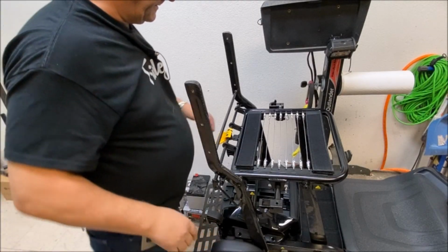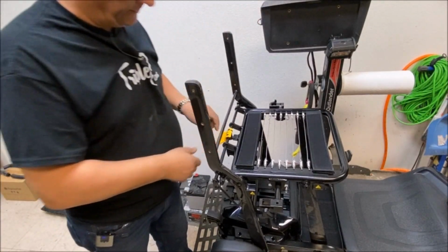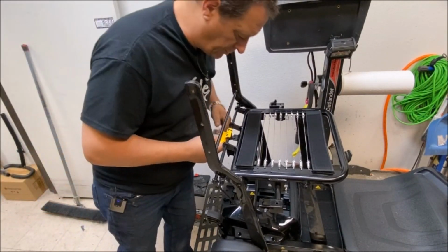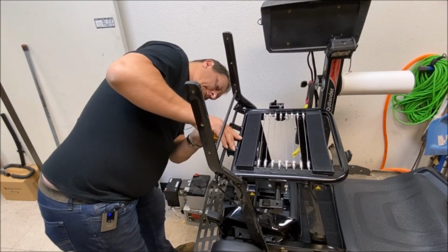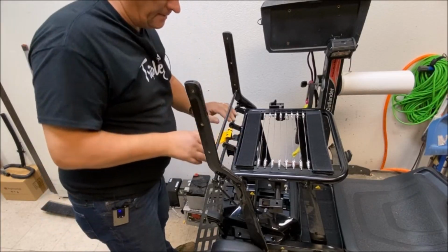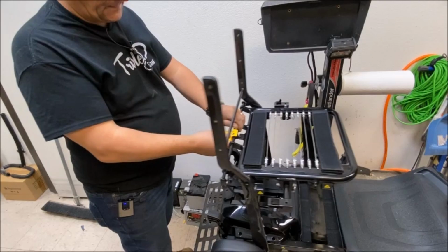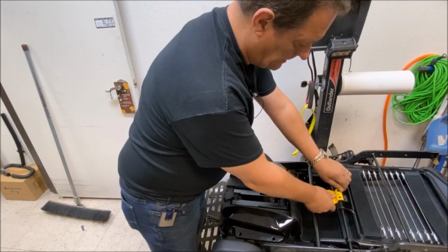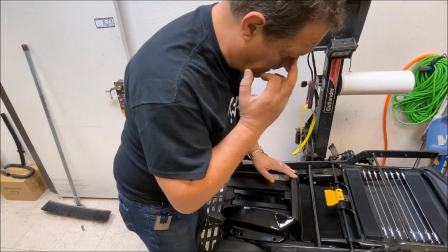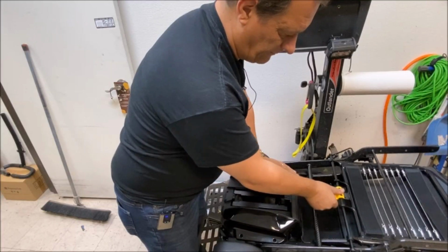So the next thing I've got to do is remove this, which is held in with 2 screws and a spring. So this may be a little bit difficult. It's under tension. No, I don't need to remove that, I don't think.